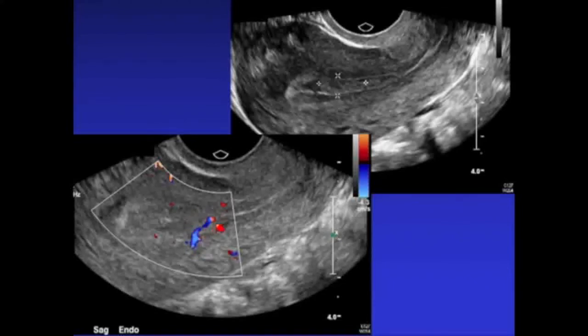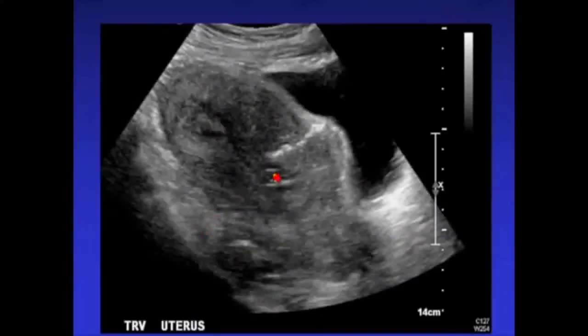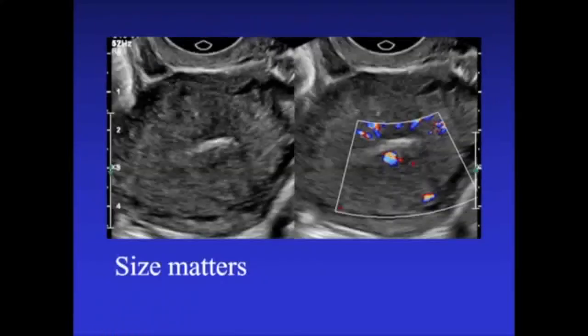And here's another patient with a small area with a small bit of blood flow here, and even though it's just a small area here, I can be very, very confident that it's most likely retained products. And the reason we want to be very careful about that is that if they decide to go in and do a D&C, you could end up with a complication like this, where they've actually ruptured her uterus. And so frequently they'll go in and they'll do this blind D&C and they'll scrape really hard, and frequently they'll end up doing this. And so we don't want them to do a D&C procedure when it's just a small area of blood products.